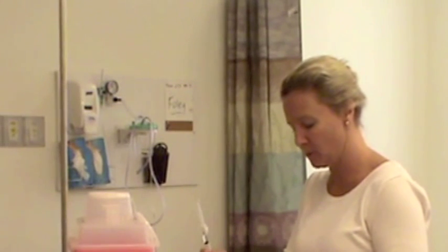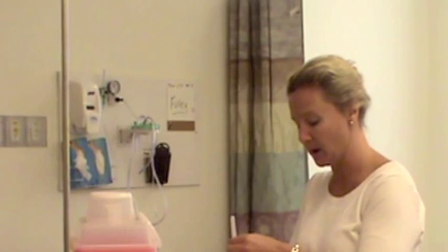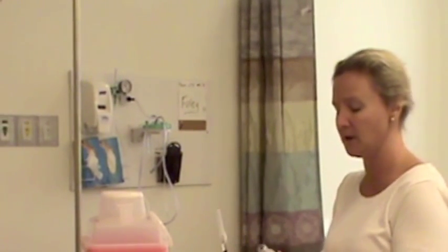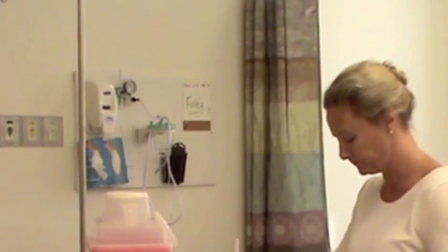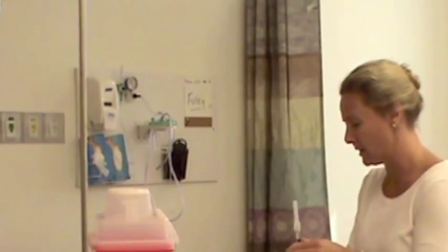Intramuscularly, I have the correct equipment. Every 6 hours, he last received it at midnight. It's 9 o'clock now, so it's safe to give. As needed for nausea, and he is nauseated, and my injectable form of my drug is not expired. So I'm going to put my vial away and lock up my med cart.